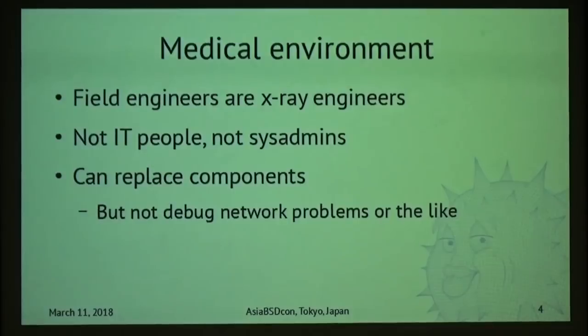To make things even harder, the field engineers that go to the hospitals and doctors' offices installing these machines are X-ray specialists, not IT people. They are not sysadmins. They know nothing about computer space. They can exchange the box, but they cannot even log in or examine anything. Or, well, they might be able to reboot them, but that's about the best thing you can hope for. And they are certainly not going to debug networking problems for you.